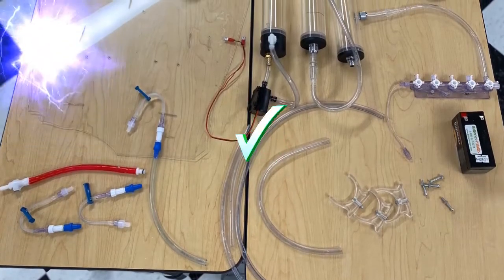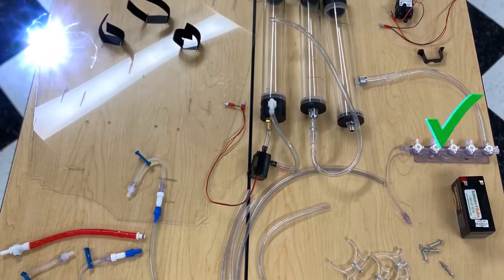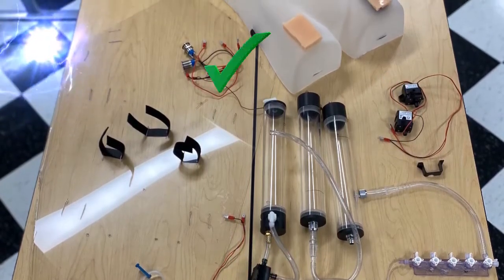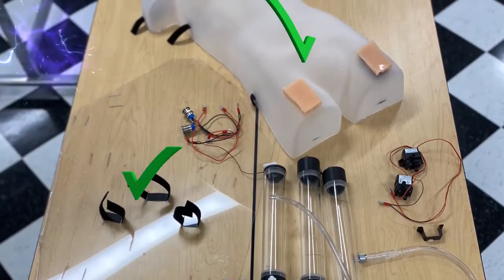Silicone hoses — check. Suturable veins — check. Battery power — check. Water tank reservoirs — check. Water pumps — check. On/off switches — check. Mannequin encapsulation — check.